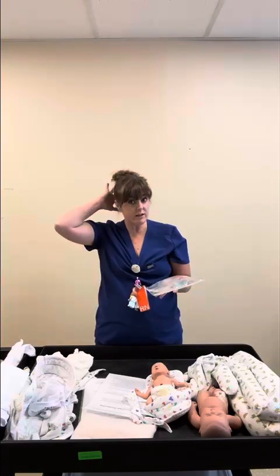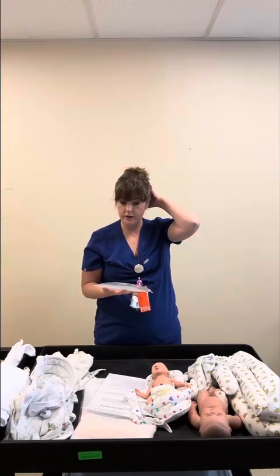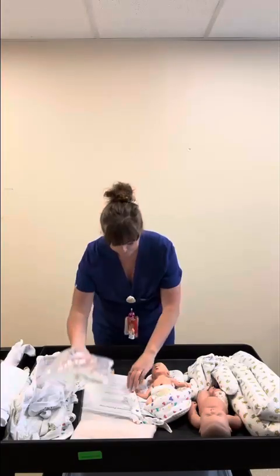The only time you would use this supine is if the baby has a really, really flat head and you've talked about it with PT, OT, the team, or if they've got some condition that needs some pressure relief back there, a sore or some congenital anomaly. Otherwise, please reserve this only for side-lying position. It is a pressure relief device for side-lying. If your baby's in the incubator, it does need to be warmed up a little bit. Hold it out in one of your incubator corners to warm while your baby's supine or prone, and then reserve it nice and warm for when they're side-lying.